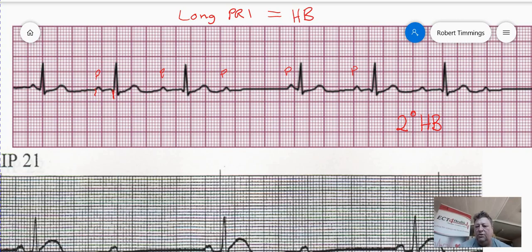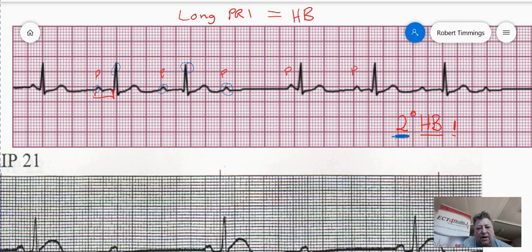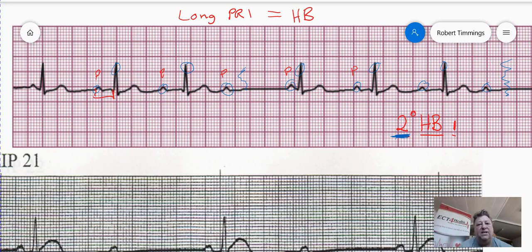This is a second degree type 1 heart block. Heart block has a long PR — we've already established that. The second degree criteria in blue: if a first degree has no missing beats, then a second degree must have missing beats. And you can see it there — P wave, QRS, P wave, QRS, P wave, nothing. P wave, QRS, P wave, QRS, P wave, QRS, P wave, nothing. It's missing beats. It meets criteria for a second degree block. So it's a heart block with a long PR, and it's a second degree because it's missing beats.